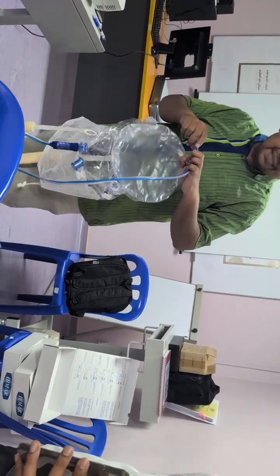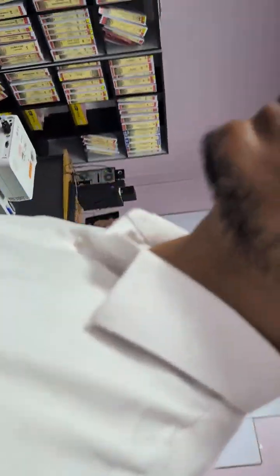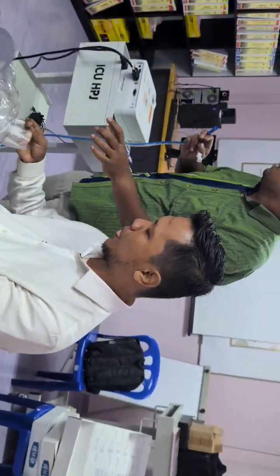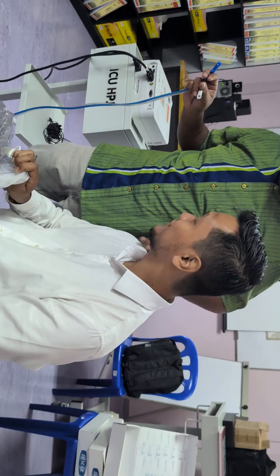Well, I mean, it's not that the balloon is not like this. A little besar, yes. That one is okay. So, same concept, absolutely same concept, this one. Okay? Relax, relax.